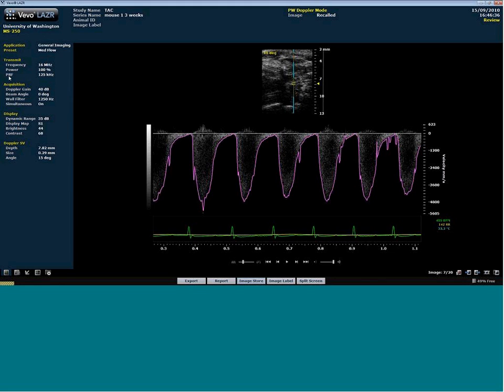So when we get up to the velocity, it says PRF here, which is pulse repetition frequency, but on a 2100 keyboard, the knob is actually the velocity knob, and it adjusts that. So we've cranked it up. Cranking that velocity, that PRF up, changes the scale here. So we've maxed it out here to 125 kilohertz.